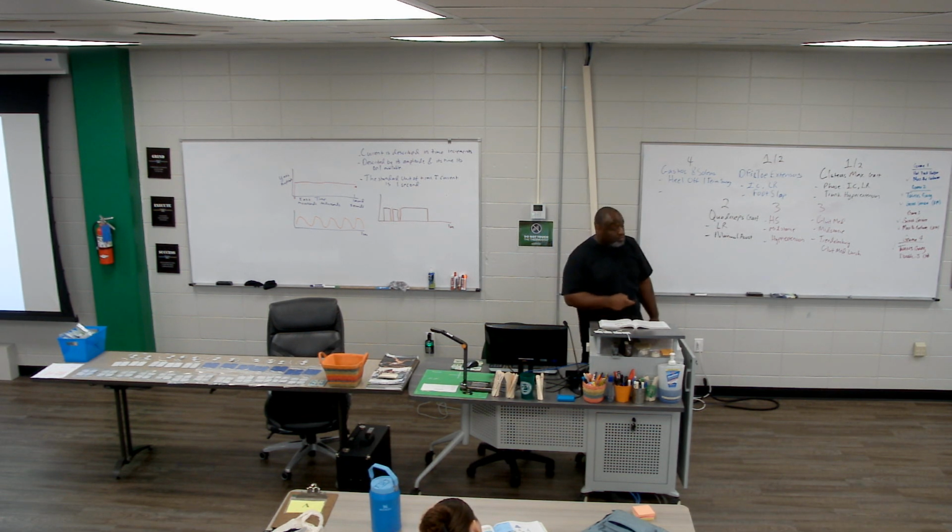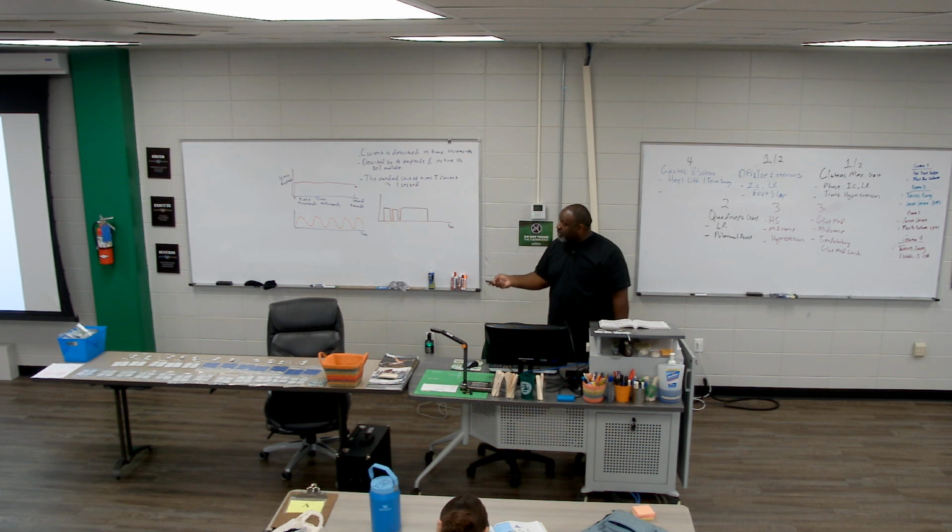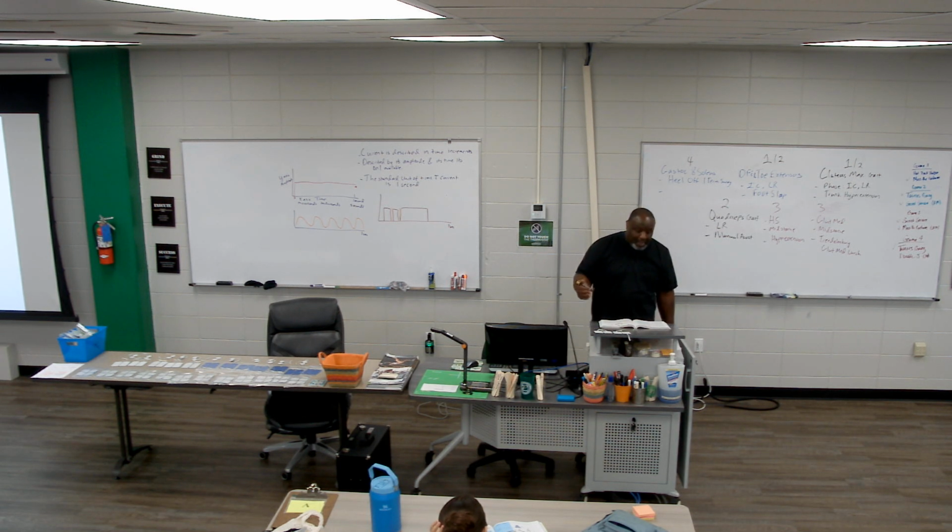Monophasic, and it's only going to be one waveform. So for that 1 second interval, we're only going to see one waveform or one phase of wave. The end of this, all the way out here toward the end, represents that 1 second interval. So in that 1 second interval, there's only going to be one phase. It's monophasic.